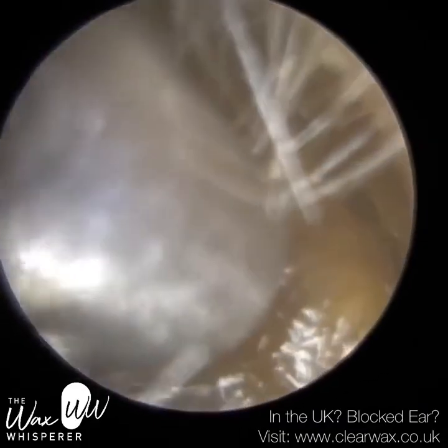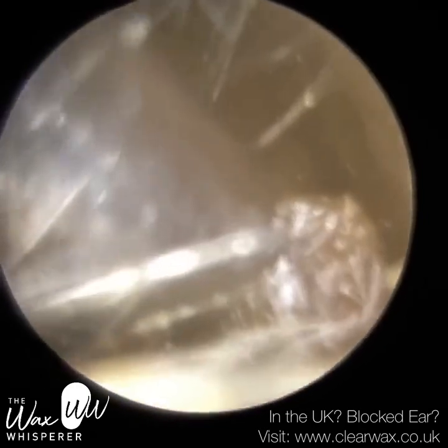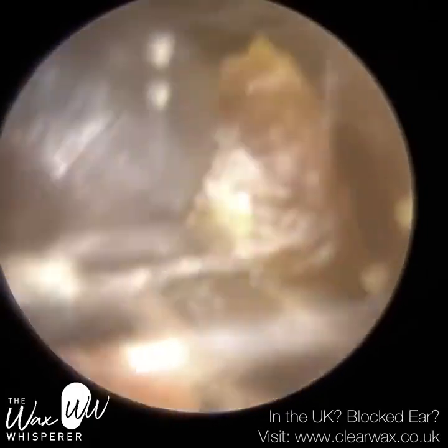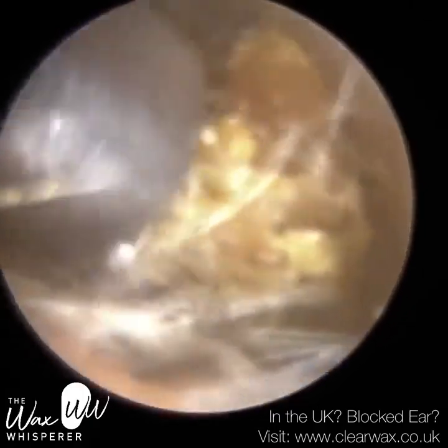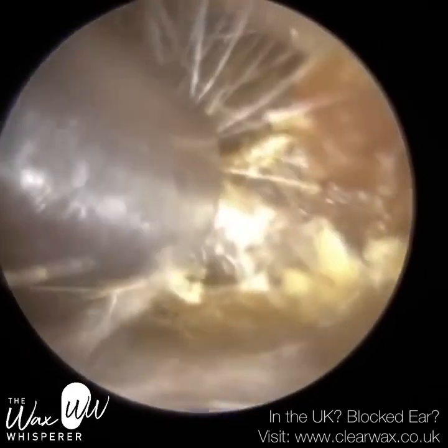We have here a patient who attended with a blocked right ear, and I'm just performing microsuction, trying to remove this plug of wax and skin that's blocking their right ear. And this plug of wax and dead skin is actually larger than the entrance of this patient's ear canal.